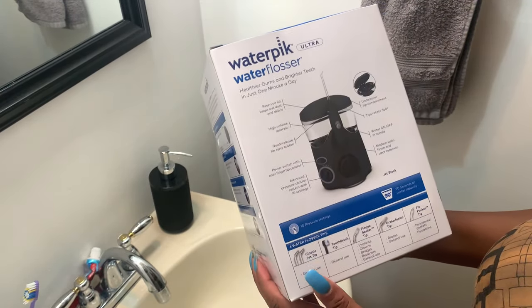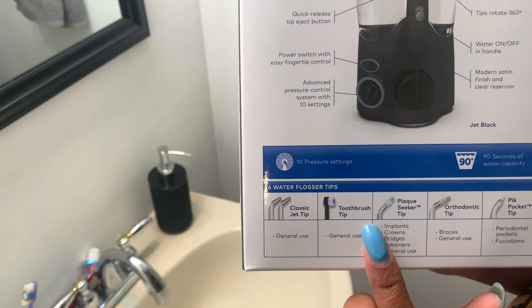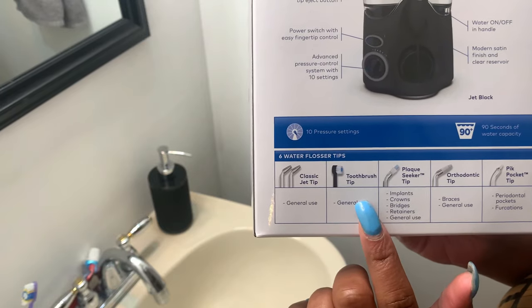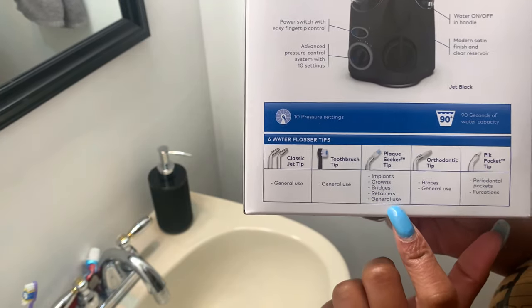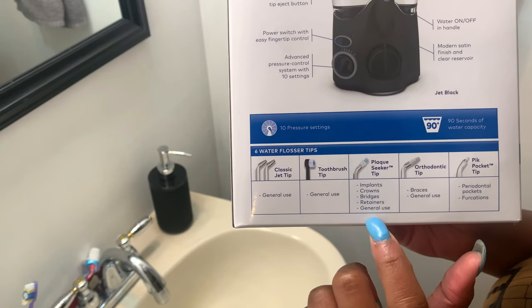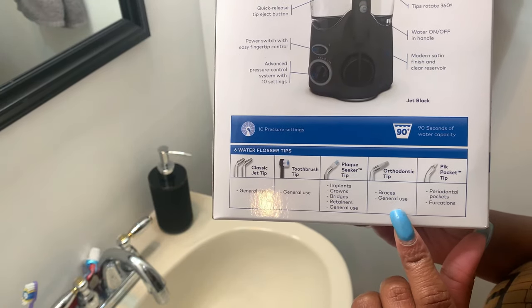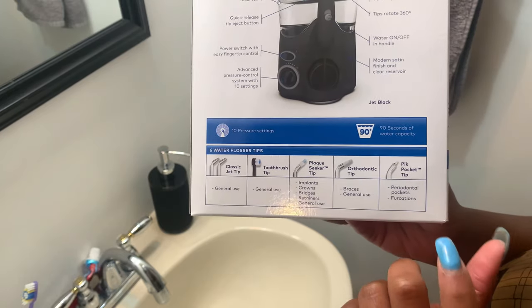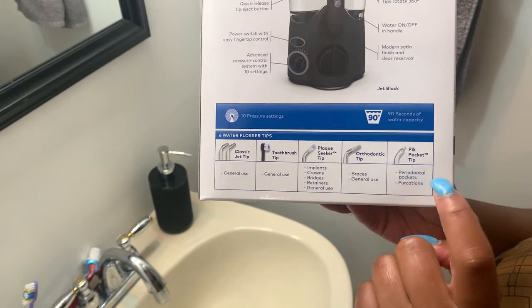You can see it has a jet tip for regular flossing, an actual toothbrush attachment that you can use — I don't use that often because I use my own, but it's cool. There's one that helps for plaque, which you can use on implants, crowns, bridges, retainers, and pretty much anything. And there's one for braces that I don't use anymore since I had braces before. Then there's a pickpocket tip — this one's my favorite that I actually use all the time.